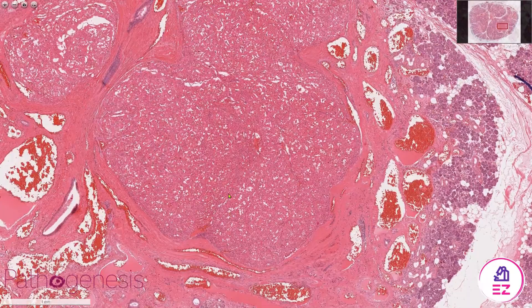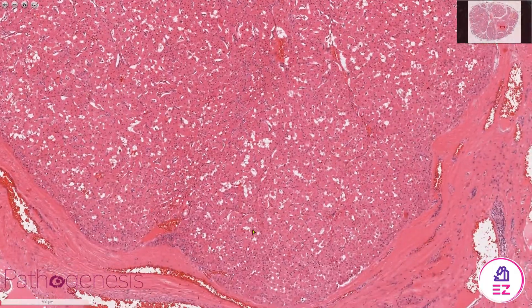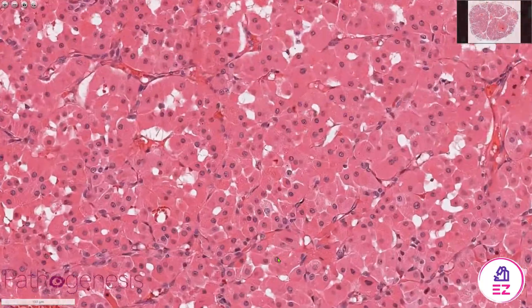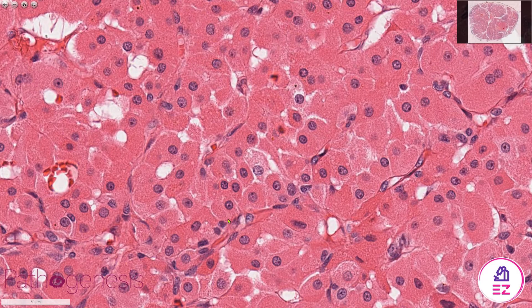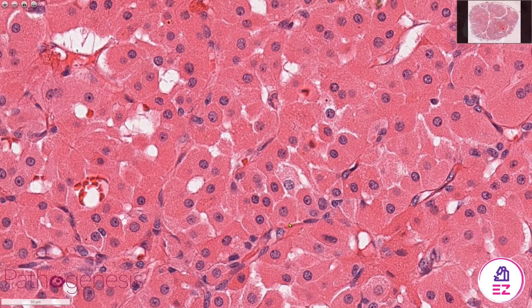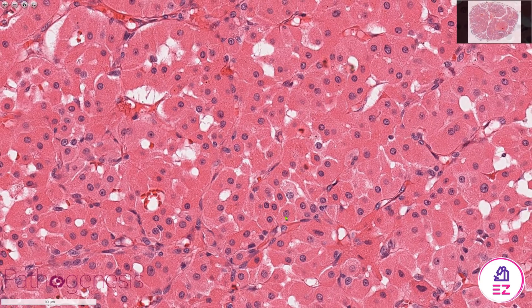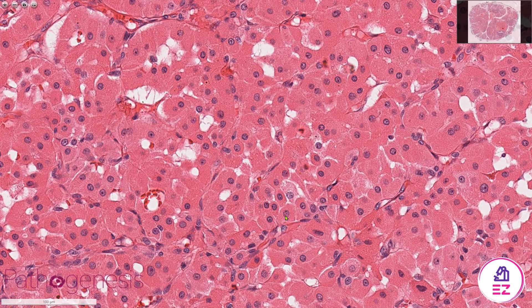This particular oncocytoma has a fairly solid appearance with a hint of a trabecular appearance in places. Looking at the individual cells, the oncocytes are often polygonal in shape with well-defined cell borders, and they're brightly eosinophilic with a granular appearance to the cytoplasm. The nucleus is nice and round without any pleomorphic features, and generally I wouldn't expect to see any mitoses or other concerning cytological features, as it is benign.